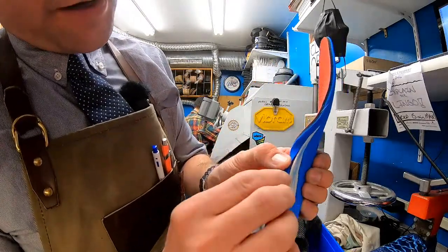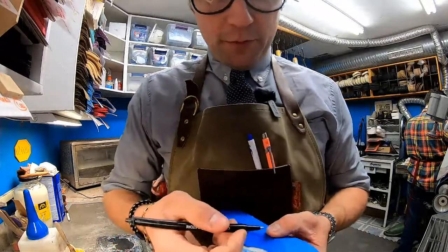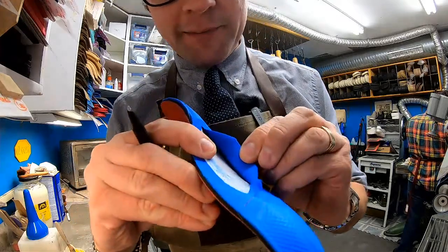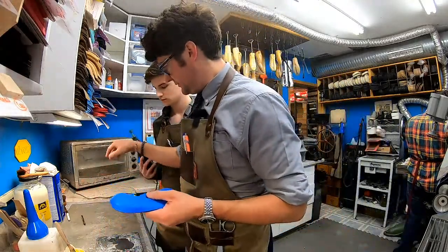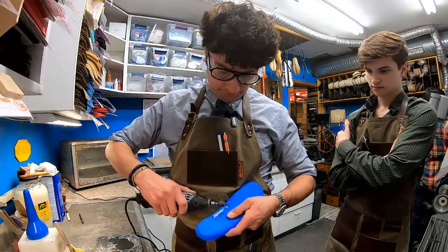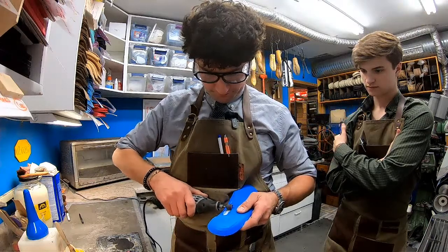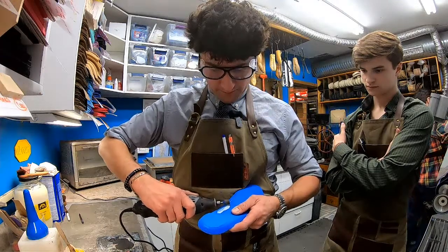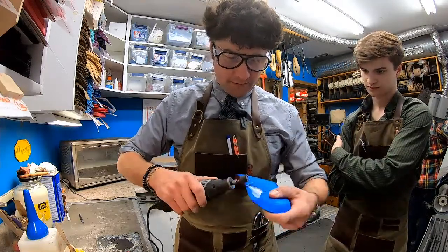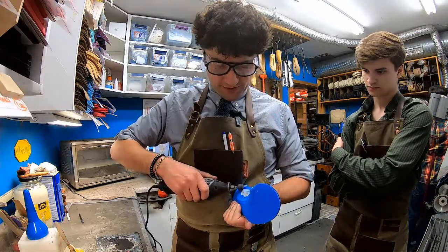If you can see, we have a thin, about 2 millimeter plastic core in the base here. Now, I haven't done this on a Power Step before, so we're going to take it with the Dremel, and I want to remove about this much. When I shave it, it peels off with delaminating pretty easily. I'm going to take this trusty Dremel. So we're working on removing this. Typically you just want to cut the line and then pull apart the excavation area. We're just going to cut the line real nicely here.